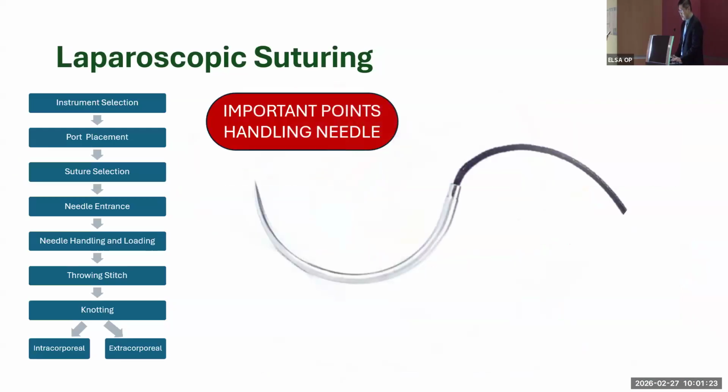Next, before we go into starting to put in the needles inside, there are a few points in the needle that you need to know. I mean, important points for handling the needle.